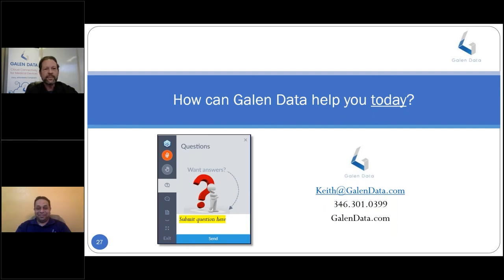Next question, when should we plan the connectivity aspect for our device? So I would say as soon as possible, even though you may not implement it right away, you want to plan it upfront. And the reason being because connectivity will change the requirements on your hardware, will change requirements on the data you collect. It changes how your device interacts, how your device works. And so you have to consider all that upfront. Also, implementing connectivity right away gives you an idea of if you're going to implement it anyways in your roadmap. Implementing it right away can give you a leg up in understanding all the issues, so you're not faced with changing things midway or towards later stages of your development.